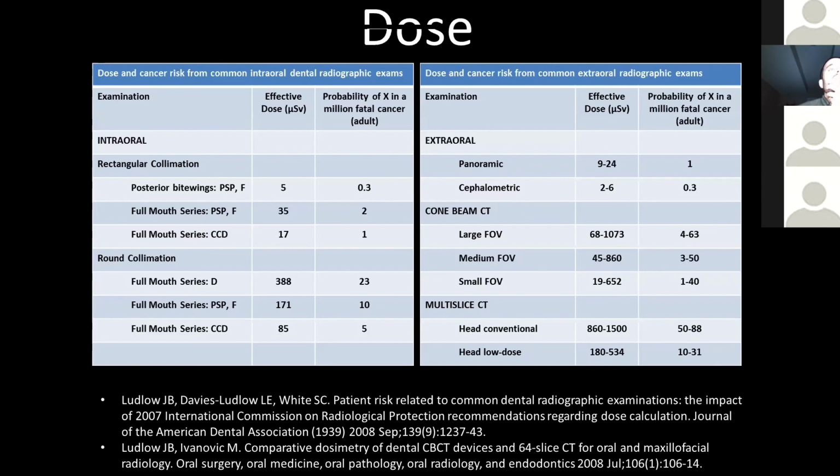The available data on extraoral bite wings for caries, again, you don't have to put anything in the patient's mouth, it kind of feels and acts like a pan, is they're pretty darn good at picking up caries. What you have to be careful for is a superimposition from the ramus and the mandible from the other side, creating kind of a radiolucent line that, if it's in the right spot, can look like caries. So it creates what we call a false positive. Once you learn to recognize those artifacts, you're probably good.